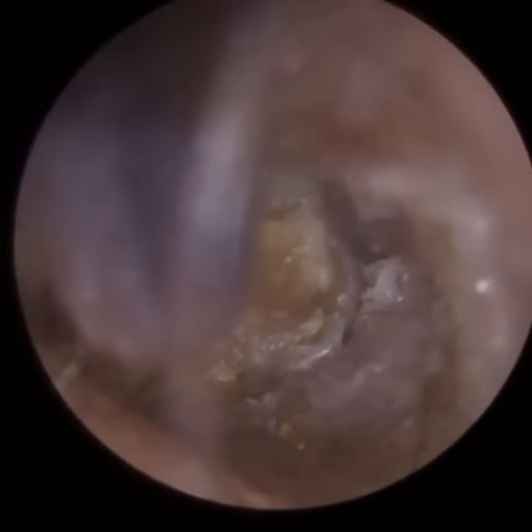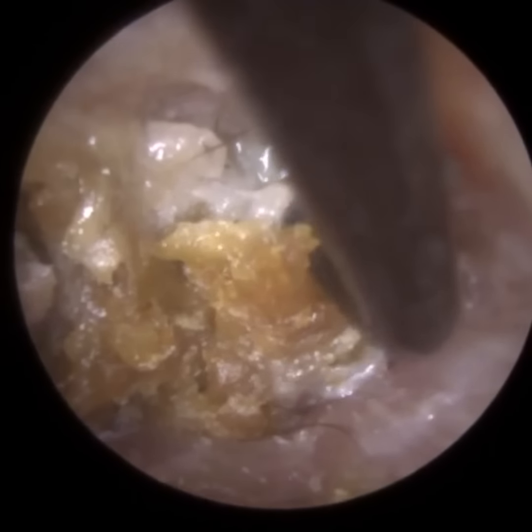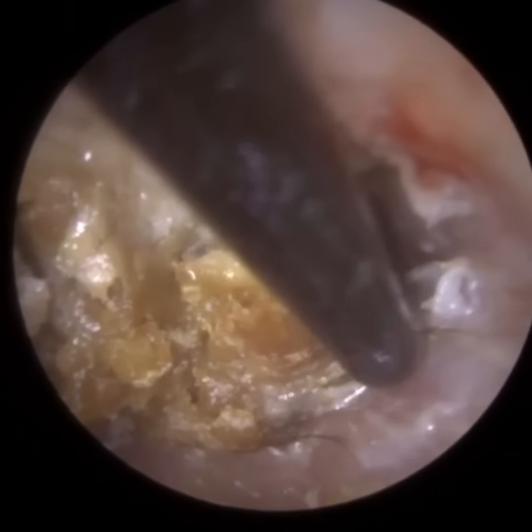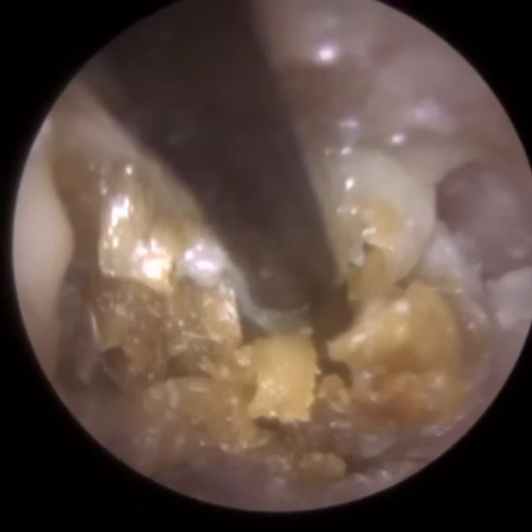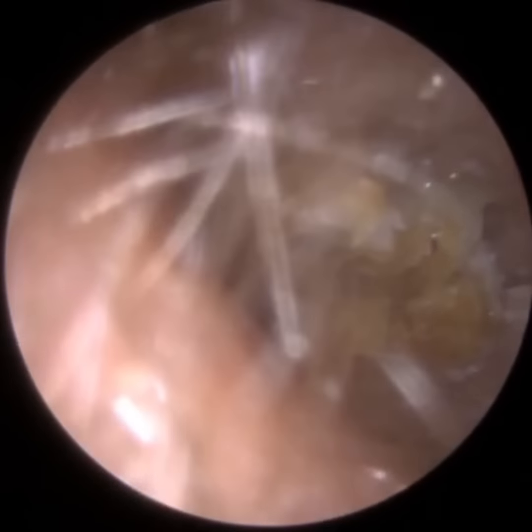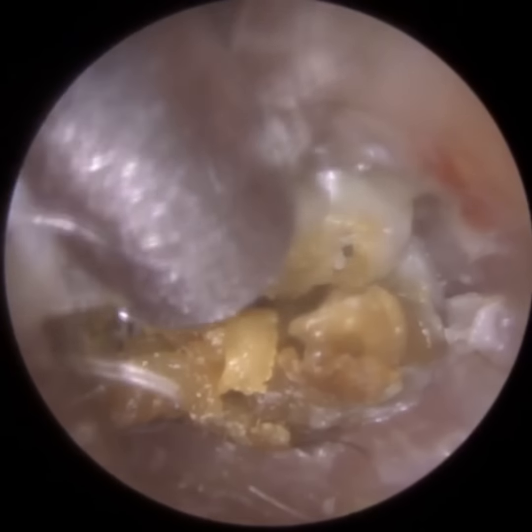So this plug is probably halfway down the ear canal, so it's still quite extensive, and I'm just gliding the hook in posteriorly, and again just being really gentle and careful with a steady hand to avoid contact with any part of the ear canal there. And again, I'm just breaking this up into little pieces. I'm going to go back in with a suction probe, I think. We shall see. There we are.